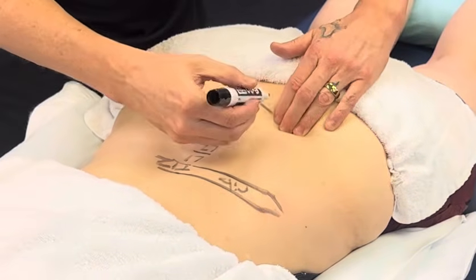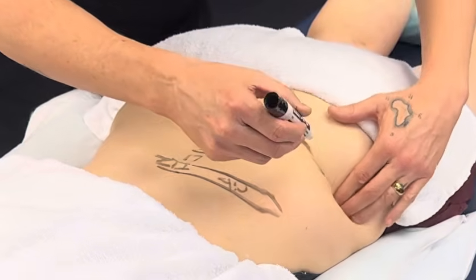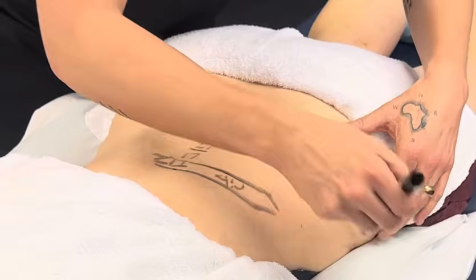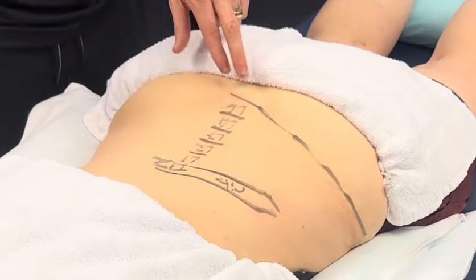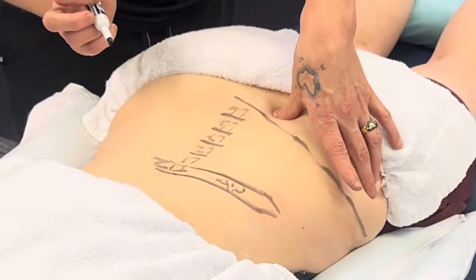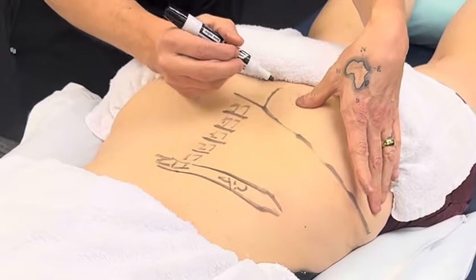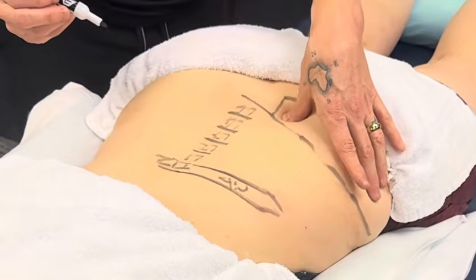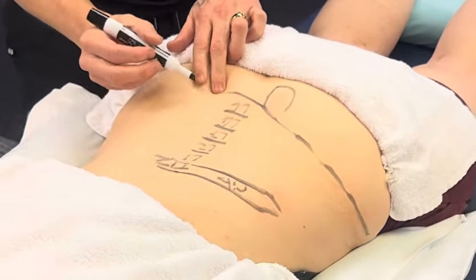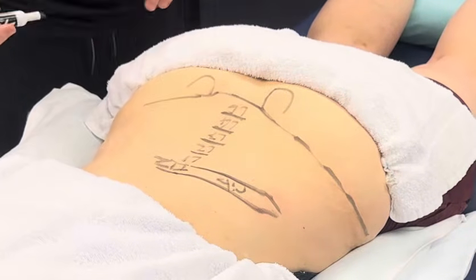We want to find our iliac crest. And she's got some trigger points along that. It's not uncommon to have trigger points in glute max and glute medius up there. We want to highlight our PSIS, which is where the dimples are. They're more obvious in some patients than others. Okay. And so obviously this will be our sacral base, etc.